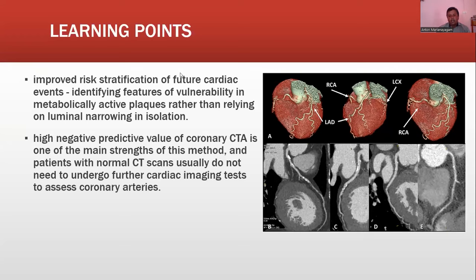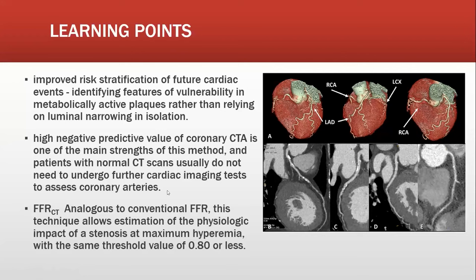And the CT coronary angiogram has a high negative predictive value. So if the CT coronary angiogram in an appropriate risk category becomes normal, then the patient doesn't need to undergo further cardiac imaging tests. Another promising development in CT coronary angiogram is calculation of a fractional flow reserve from CT coronary angiogram, which is analogous to conventional fractional flow reserve measurement. That means we measure the pressure difference in the normal vessel as well as in the post-stenotic area in a stenosed vessel. And then we decide whether the particular stenosis is flow limiting or not.